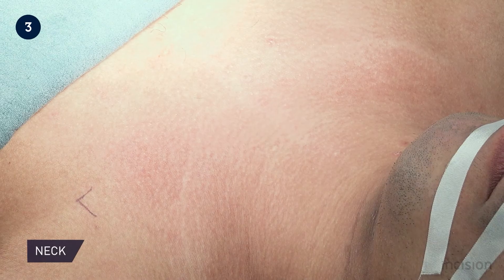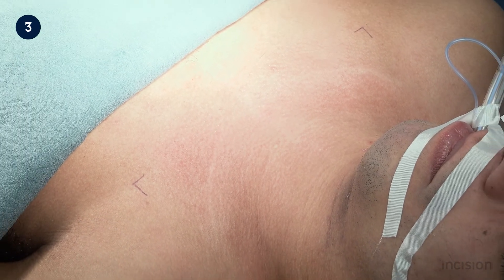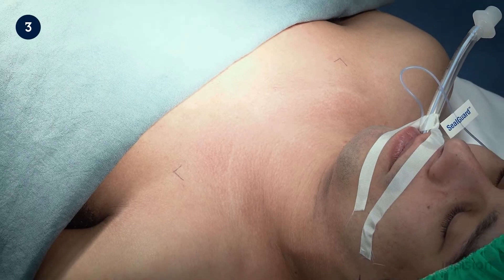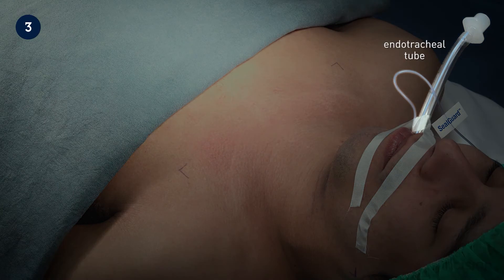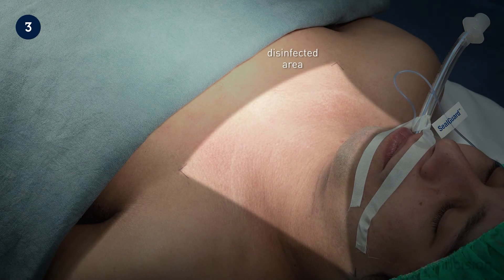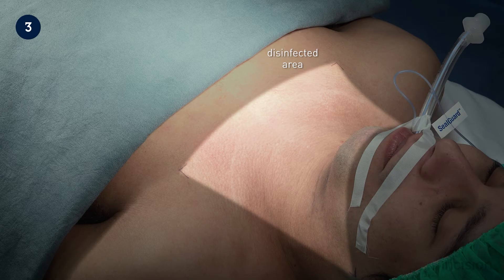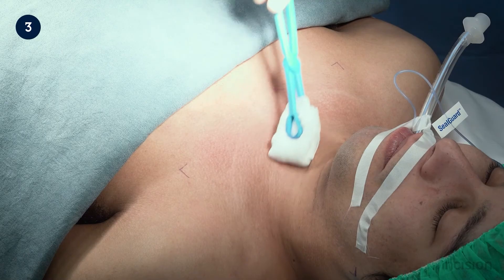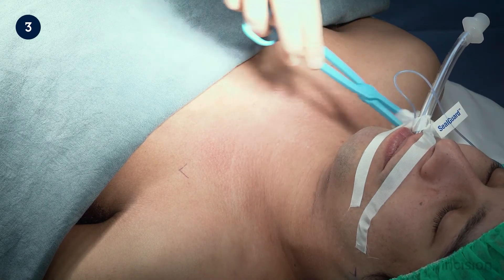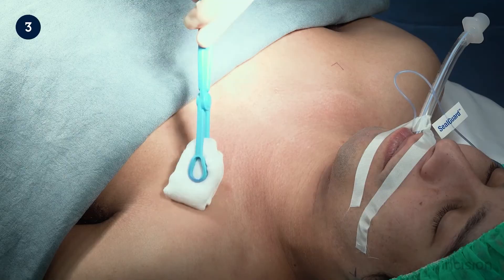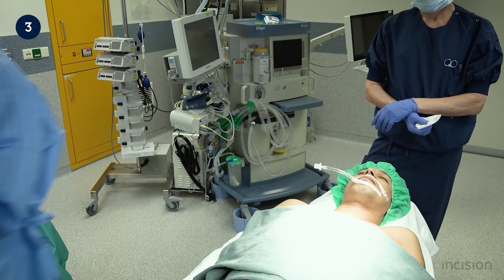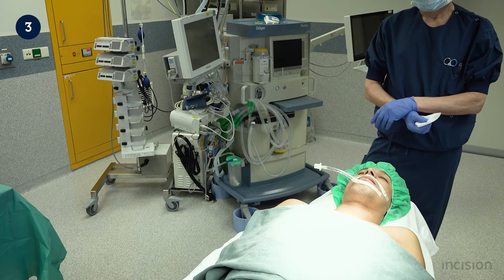When draping for head and neck surgery, such as a thyroidectomy, consideration needs to be given to airway devices which may be present. Here, intubation of the patient has been simulated. In working to clean and drape the surgical site, the sterile team must maintain awareness of the airway device and maintain good communication with the anaesthetist. The skin is disinfected, starting over the incision site and adjacent skin, and then working away. Care is taken not to dislodge the ET tube.